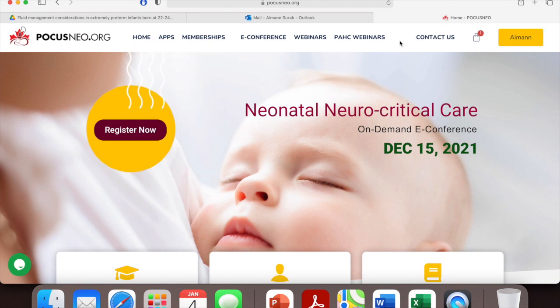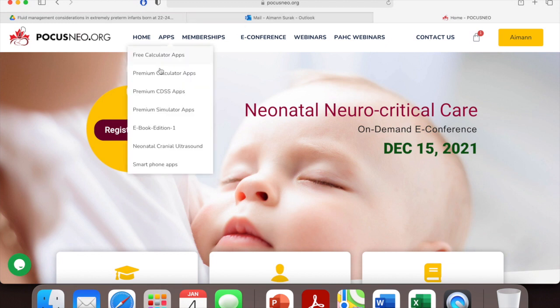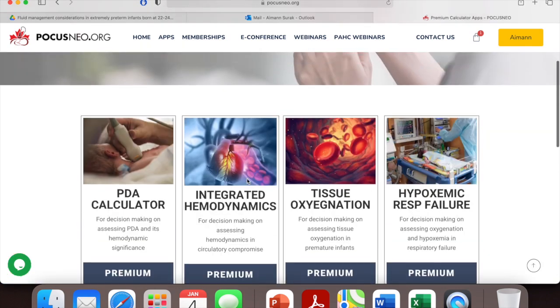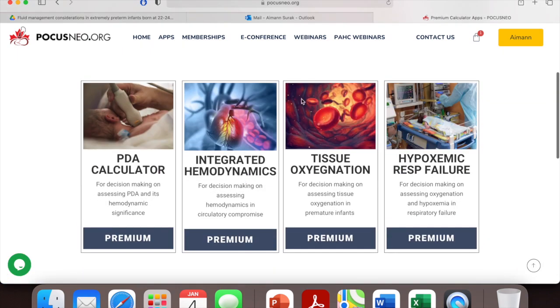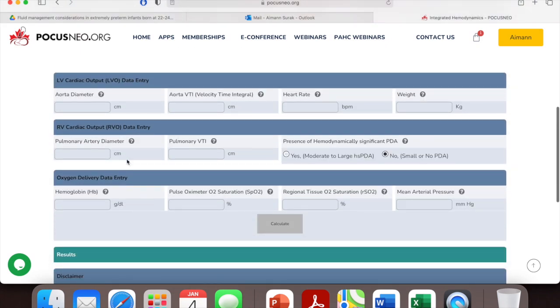I'm already logged in here. To calculate the SVR, you go to the apps section, then go to premium calculator apps, which will take you to a few of their apps. Click on integrated hemodynamics and it's going to show you this page.